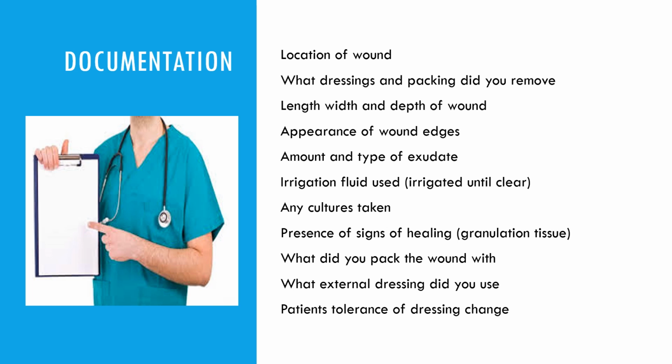Amount of the drainage: is it scant, moderate, or large, and what type of solution you used. And then was the wound packed? If yes, what and how many pieces you used, and what external dressing you used, and how the patient tolerated the procedure. Another thing you need to mention is if the patient was given analgesic prior to the dressing change or after the dressing change.